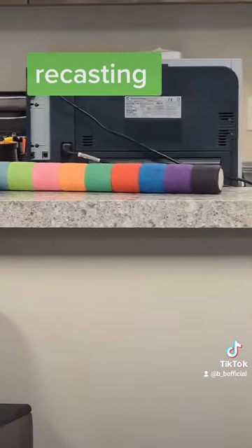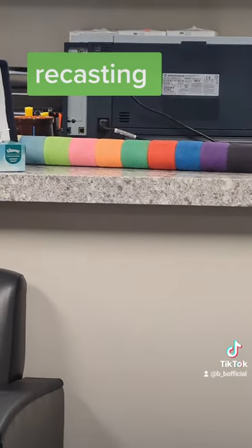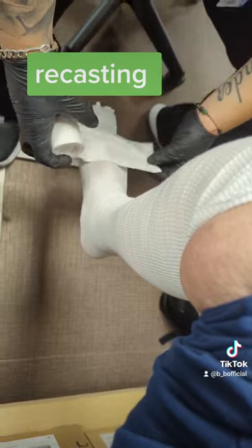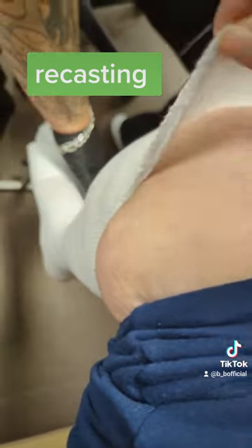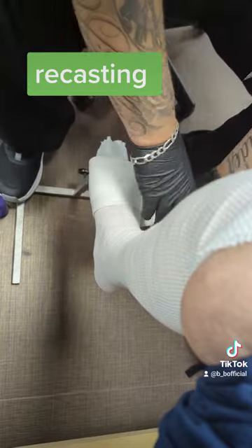Here are the colors I picked: forest green on top and neon green on the bottom. Everybody, this is just the beginning.